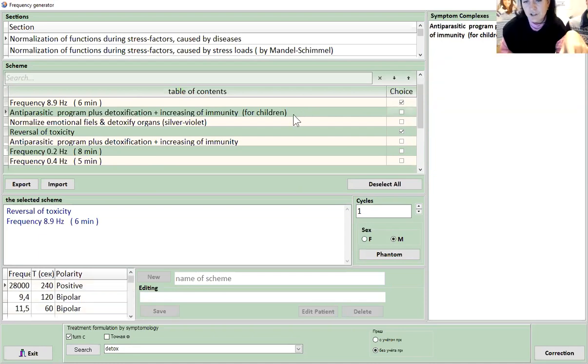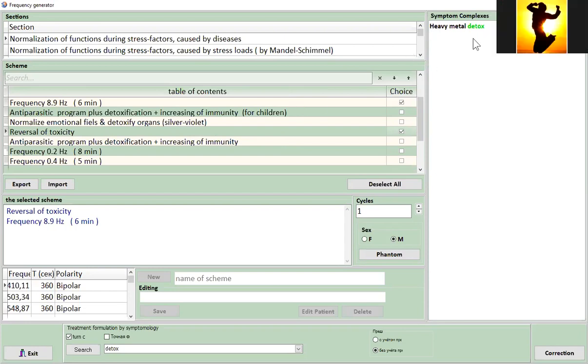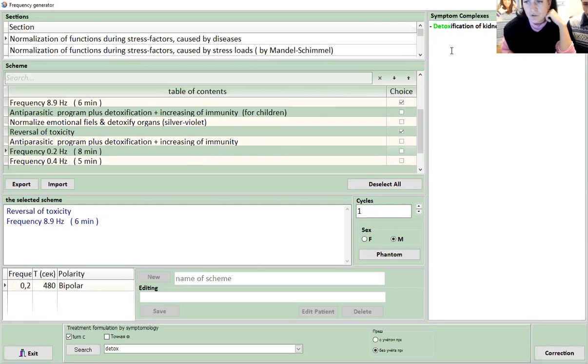Because it shows you here the variations of detox. You can press on every one and it will explain what it means. For example, reversal of toxicity, it is heavy metal detox. It says here. Oh, it's up top. I see. Okay, my screen was blocking that with the pictures. So every frequency you press and you see the detox. Okay, I see now. Thank you.